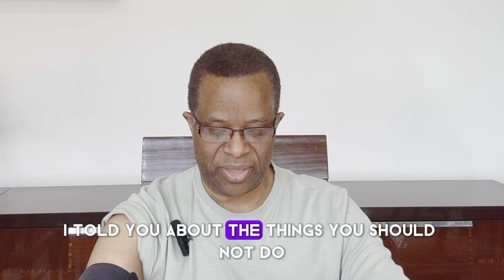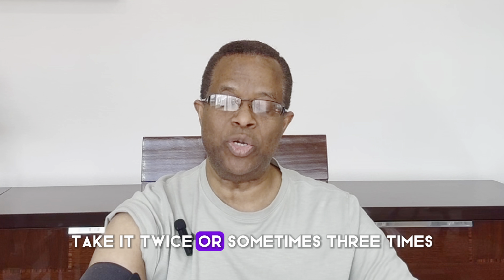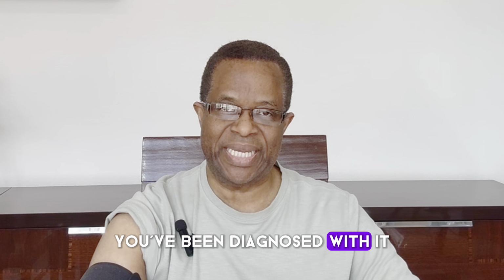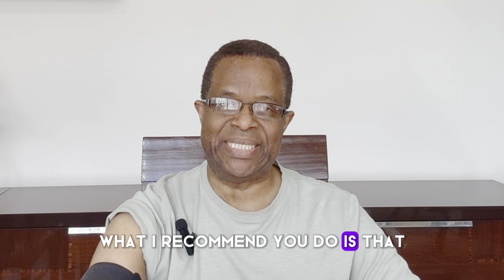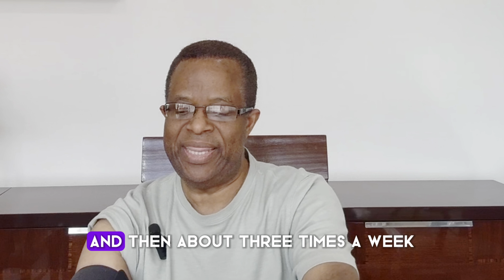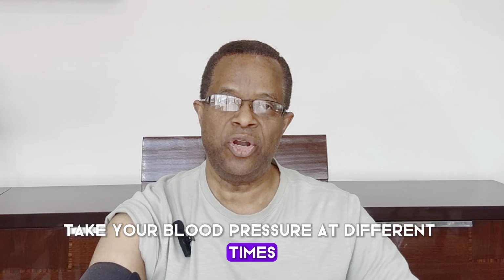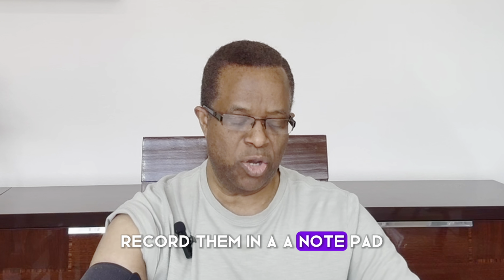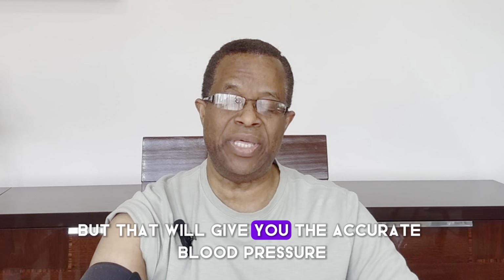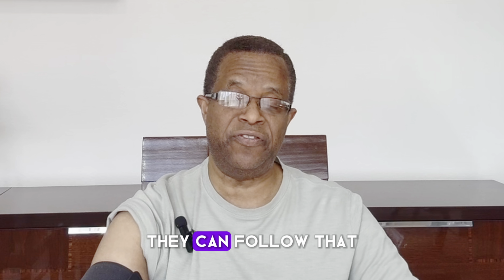And again, I told you about the things you should not do when you are taking your blood pressure. Take it twice or sometimes 3 times. And if you do have high blood pressure, you've been diagnosed with it, what I recommend you do is have this blood pressure cuff with you, okay? And then about 3 times a week, take your blood pressure at different times, record them in a notepad, and then when you go to your doctor's office, show it to them, because that will give you the accurate blood pressure. And if they need to make changes to your medications, they can follow that.